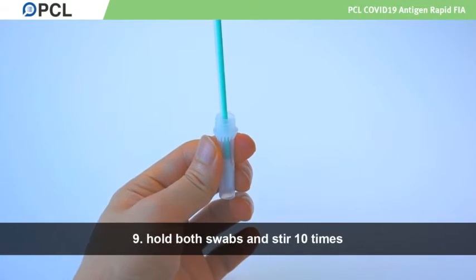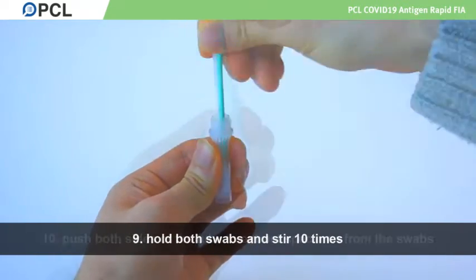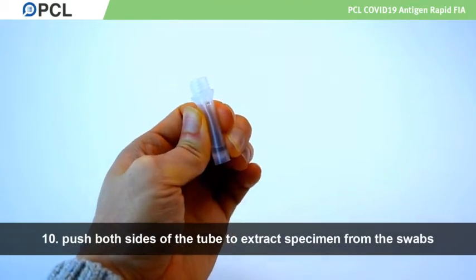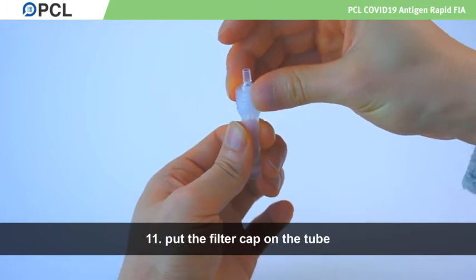Hold both swabs and stir ten times. When pulling the swabs out of the tube, push both sides of the tube to extract the last bits of specimen from the swabs. Put the filter cap on the tube.